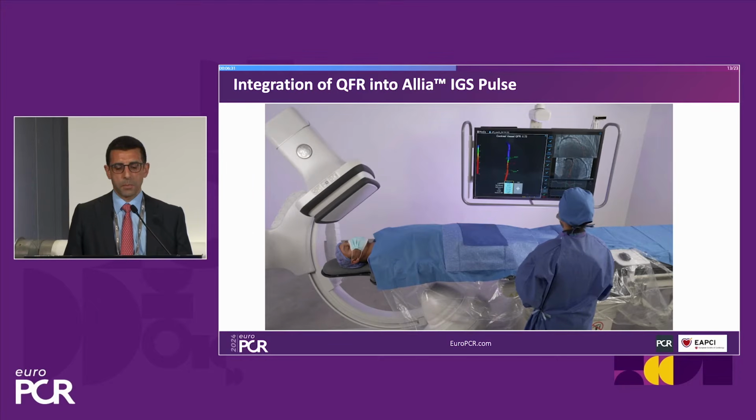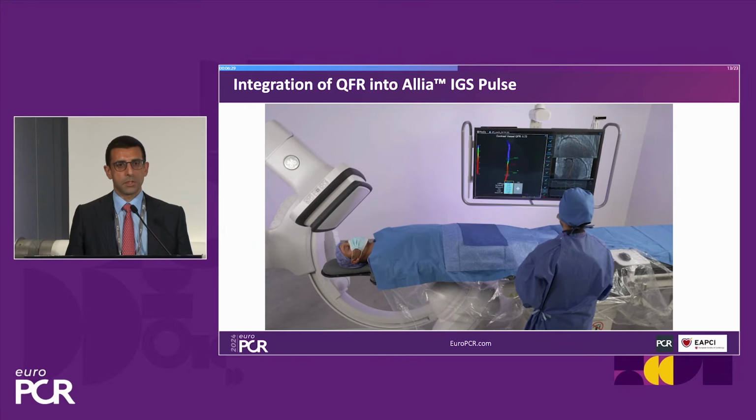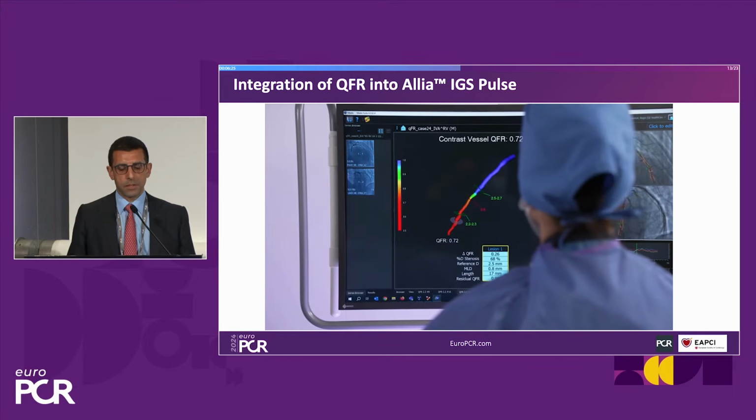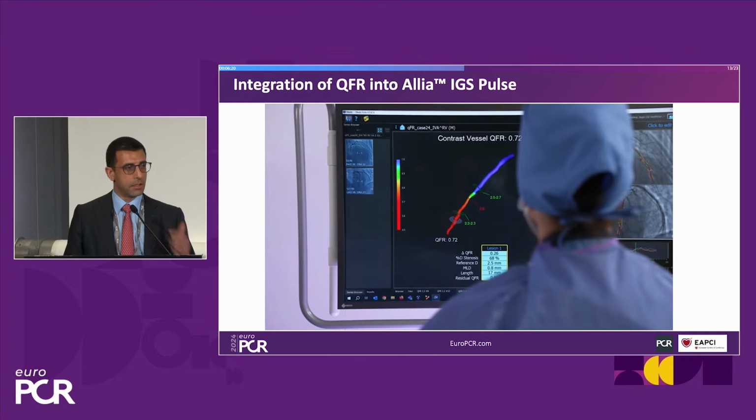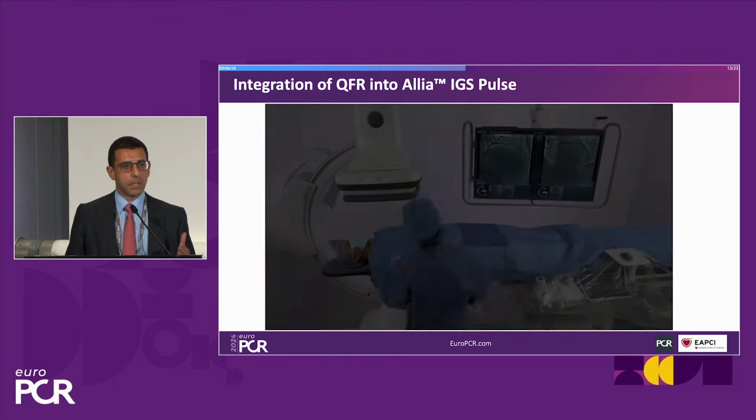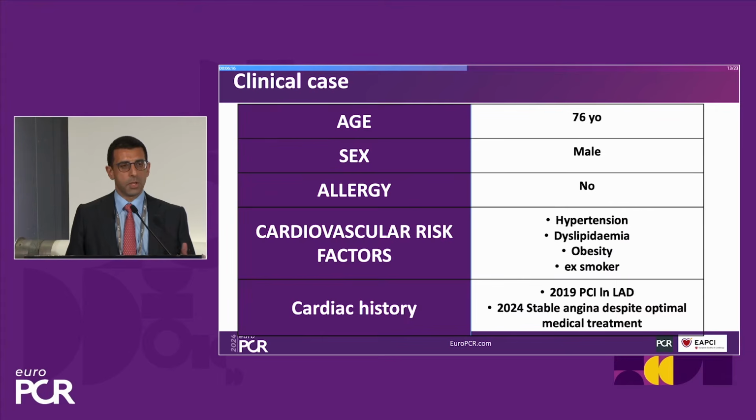That is, to me, very important when we have to find out which is the correct or the most appropriate orientation, to see, for example, where the stenosis is located, so if we want to localize perfectly well from where to implant the stent. So that is an additional feature which to me looks very interesting. So let me show you a case.